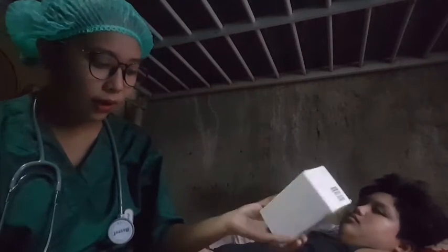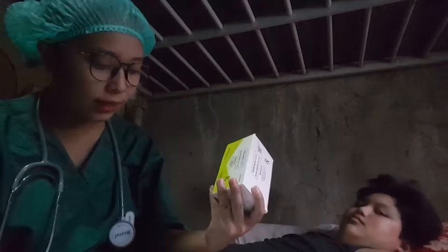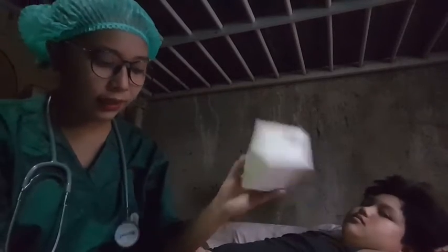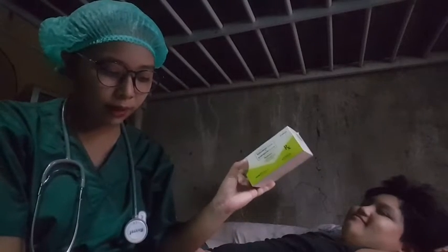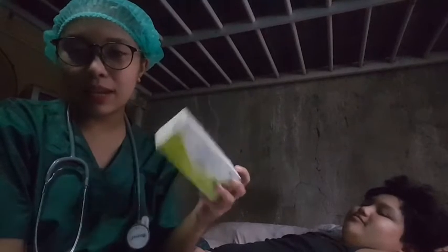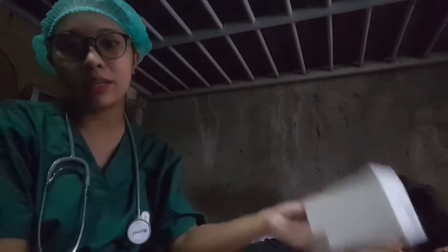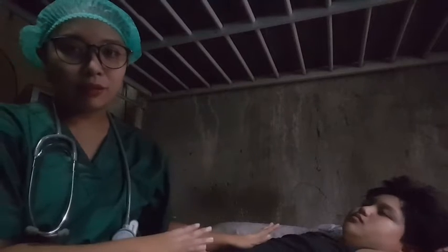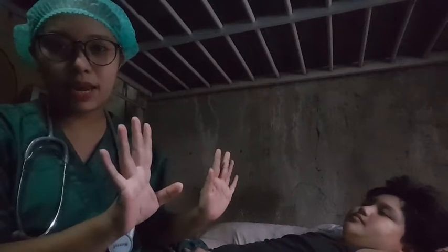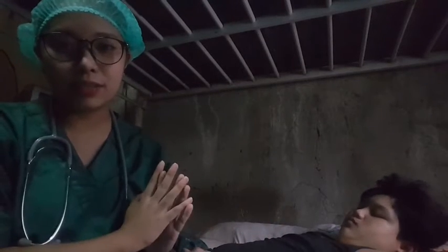It is indicated in the routine management of chronic bronchitis and patients suffering from chronic obstructive pulmonary disease or COPD who require treatment with both ipratropium and salbutamol. We are going to use this as an example, but not in the nebulizer, because our patient is completely normal, so we don't have to use any medication. This is just an example for a return demonstration.